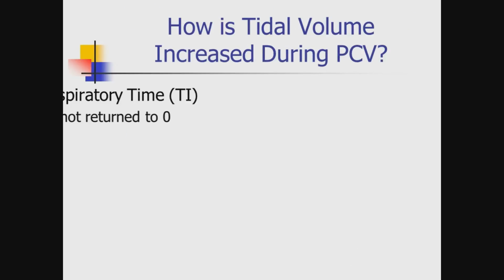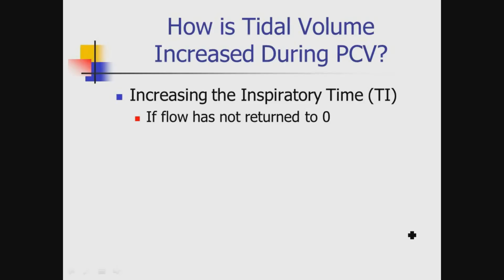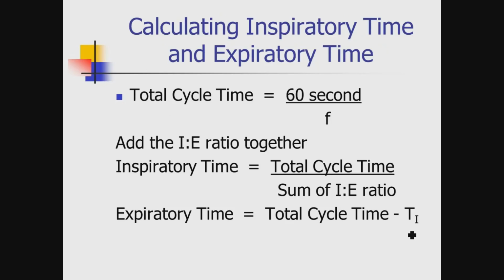So how do I increase tidal volume? Well, I go ahead and make sure the I time is optimal. I'm getting the full bang for my buck, and then going up on the pressure limit. This should not be anything foreign to you, calculating inspiratory and expiratory times. We've been through this a thousand times. Okay, it is foreign to you, but we've been through this before.